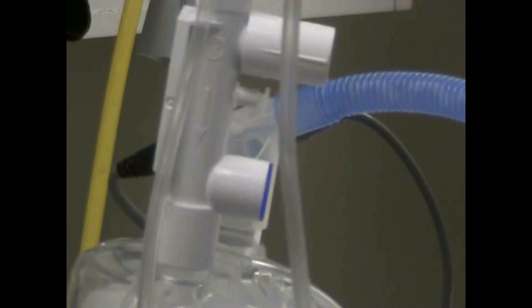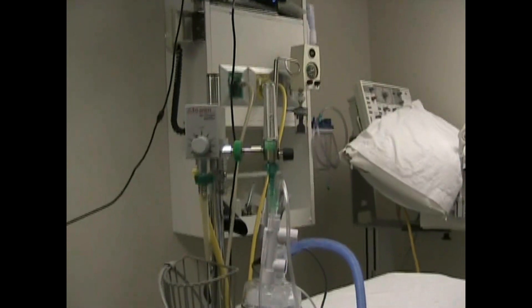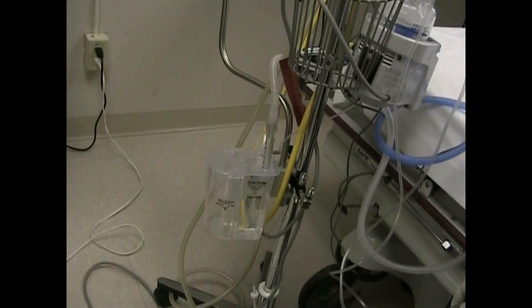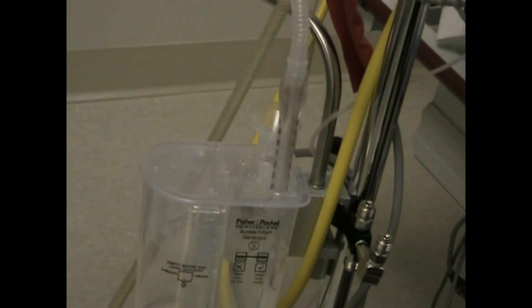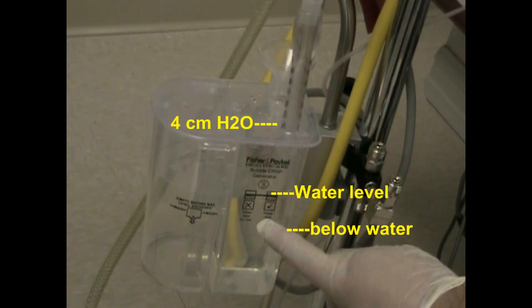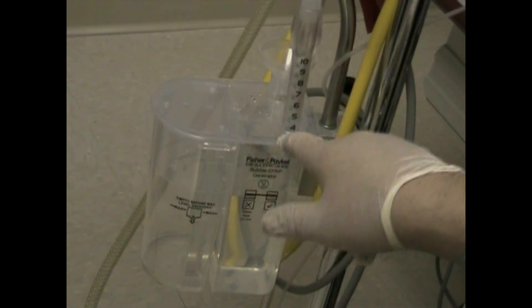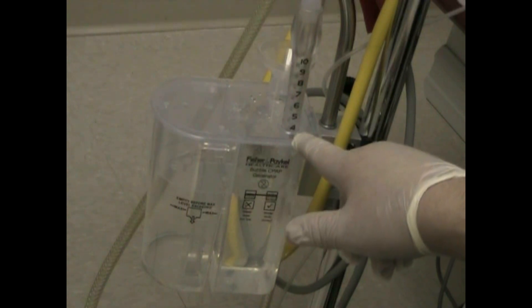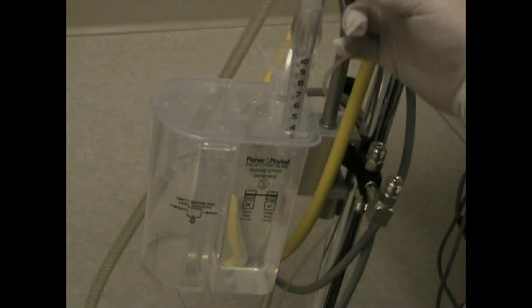Now we have things that are a little bit fancier. We have essentially all the same equipment, but now we have a manufactured bubble CPAP. This is one of several devices available — this one is by Fisher Paykel. You have a water level that is required, and a CPAP stem where whatever number is showing is your CPAP. It's very easy to move this up and down; in fact, sometimes it's too easy, and it may be best to tape the tubing to your port.